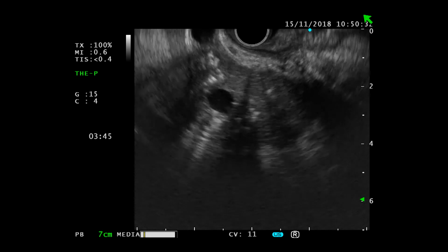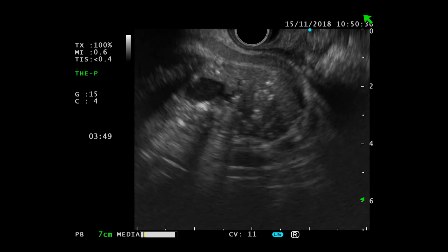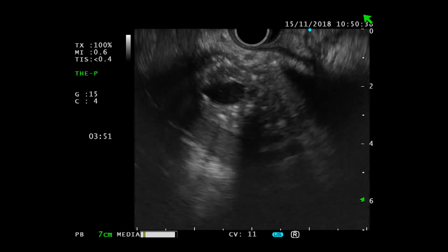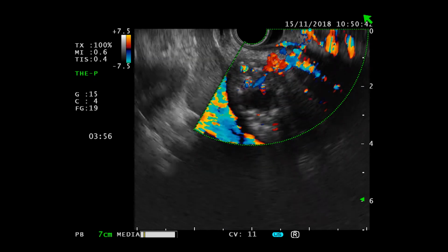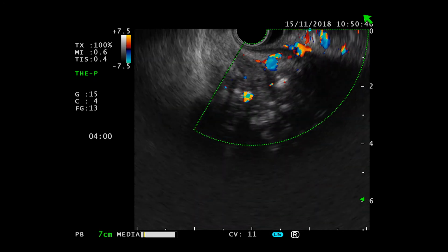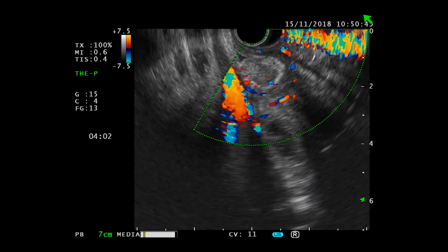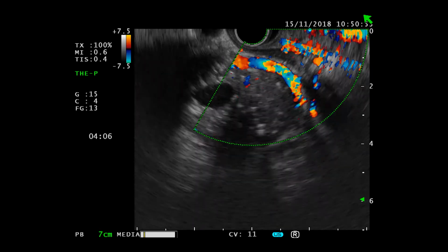Okay. Good. So you are going to biopsy the lesion or not? Yes. Great. What are you preparing? Which kind of needle? Yes, we are using a needle from Olympus, EZ Shot 3 Plus for biopsy, as you suggested just a minute ago. So we want to see the needle now. Okay, please show the needle.